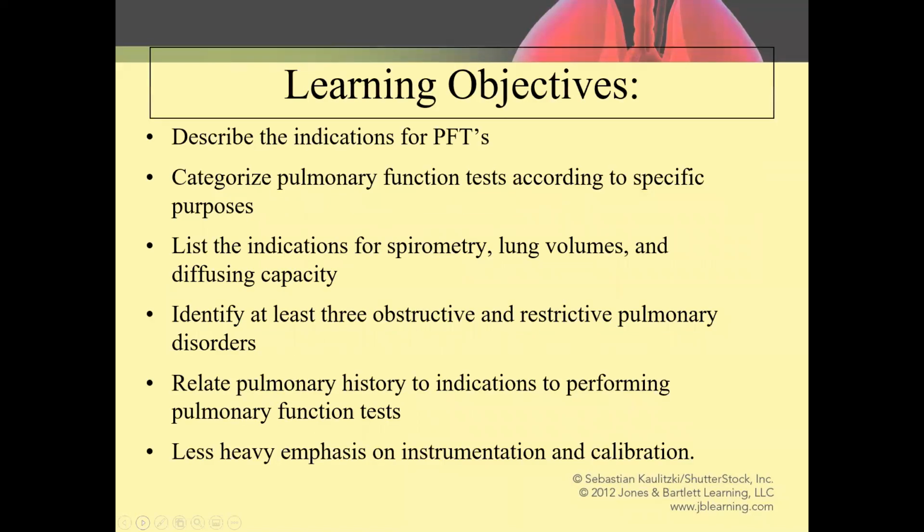So some of the specific learning objectives: we're going to describe the indications for pulmonary function testing. It's a little bit variable because the suspected dysfunction may actually dictate what specific pulmonary function testing is done. We're going to take a deeper dive into some of the dysfunctions and the testing that can be done, and categorize the pulmonary function tests according to specific purposes.